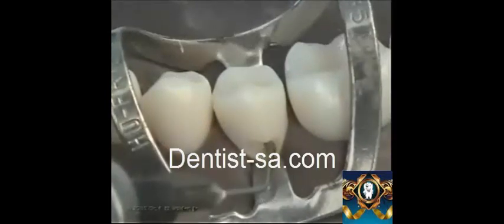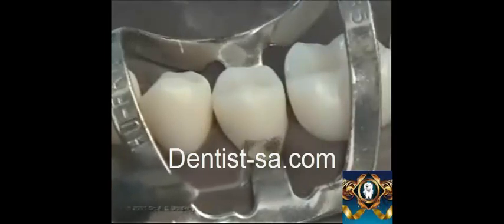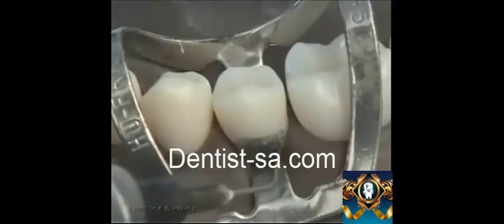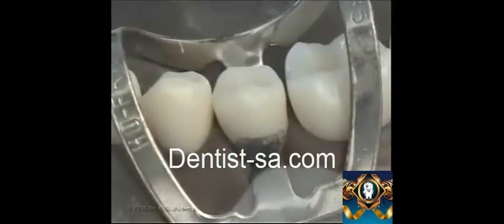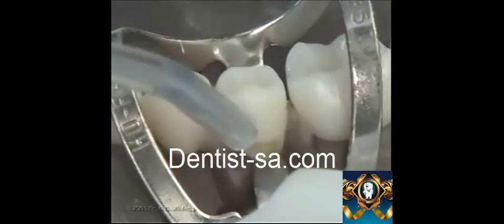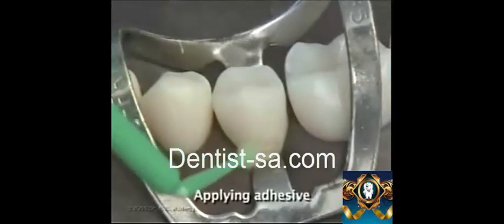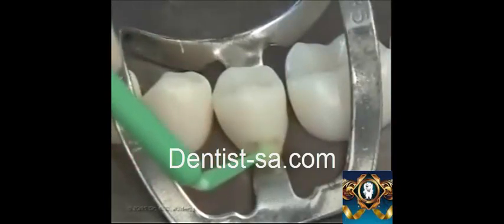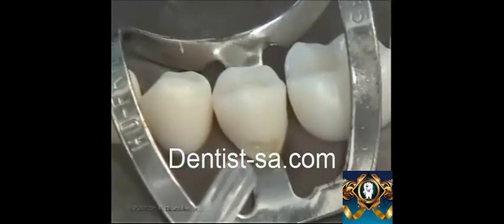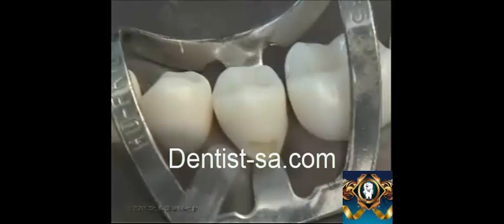This is followed by application of acid etchant for about 20 seconds, followed by thorough rinsing and drying of the preparation. Etchant has been applied and now it is being rinsed off. To remove all remnant etchant, it is now being dried. The cavity preparation is thoroughly dried. This is followed by application of dentine bonding agent using an applicator tip. A slight amount of air is applied to prevent pooling of the dentine bonding agent, followed by light polymerization for 20 seconds, or according to the manufacturer's instructions.